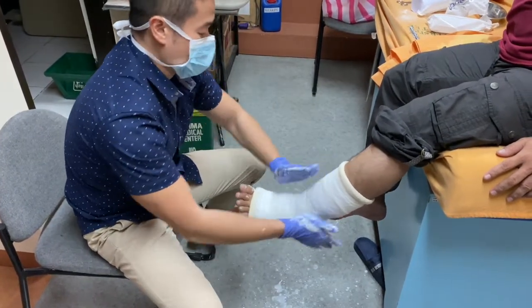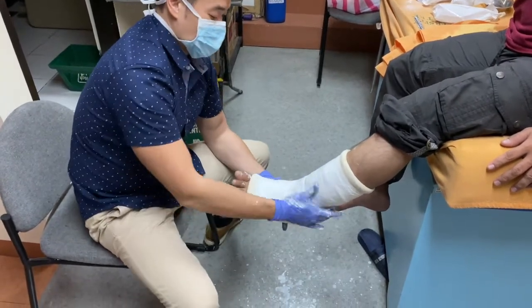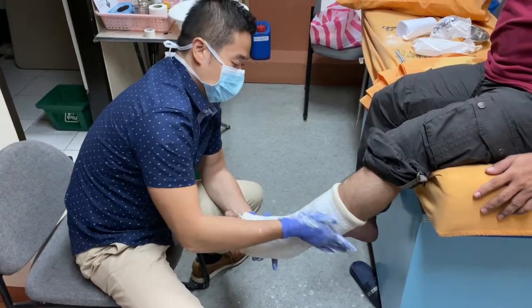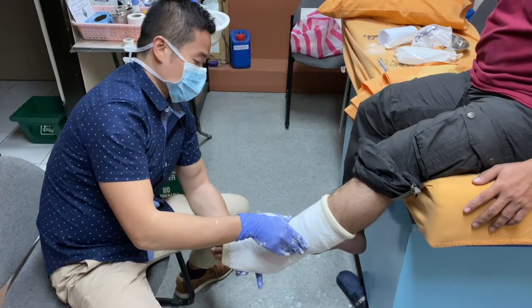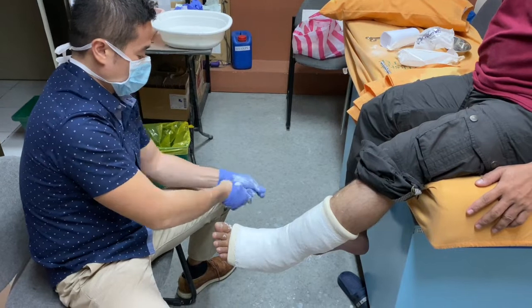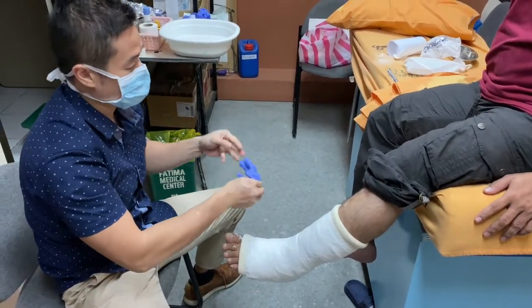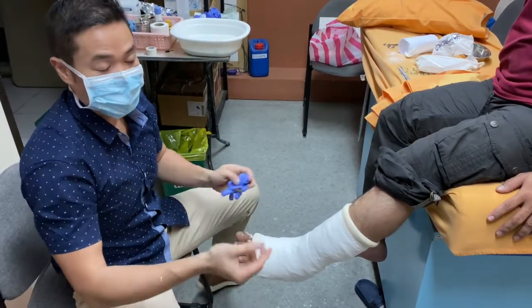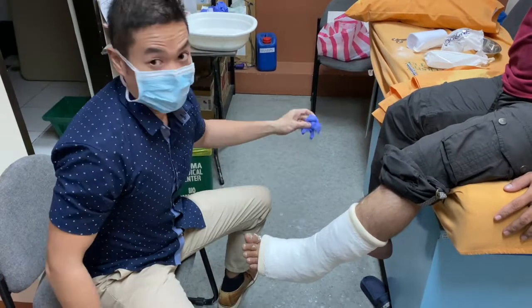Usually the cast will set for around 10 minutes. Tell the patient that he or she may feel a little warmth or heat. That is why there is a limit on the number of layers — more layers of plaster of paris mean more risk of thermal injury due to the exothermic reaction during setting.